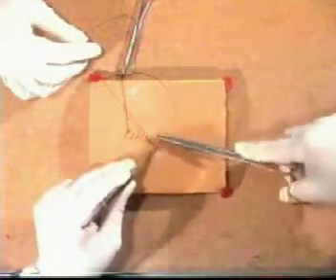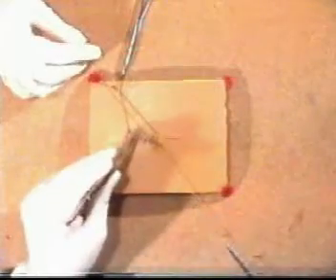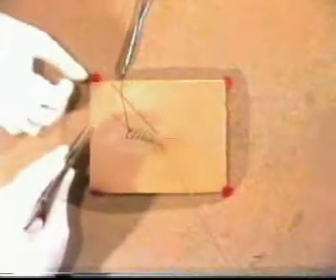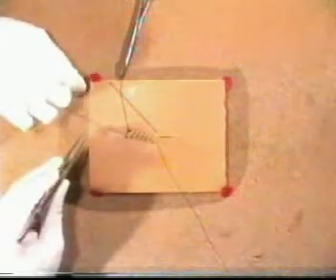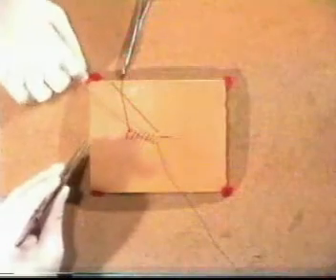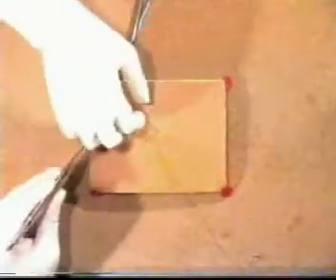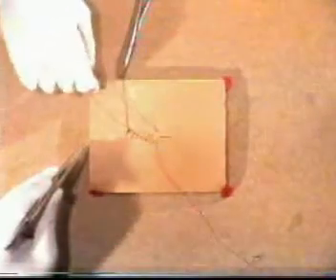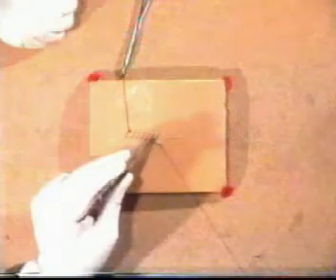Unfortunately, in this case, the assistant was not alert and allowed the suture material to twist around an instrument. It now becomes increasingly difficult to untwist this and panic sets in. The assistant then starts to put their hand into the middle of the surgeon's view, which is even worse, but eventually the suture material is freed.